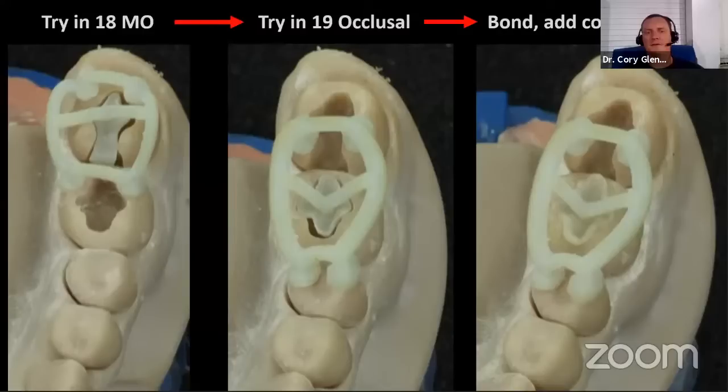Well, with this, all of those key areas of anatomy are being located ahead of time. And these little feet index it into the tooth so that it's in the perfect position as their pre-op anatomy or their wax-up, if their tooth was bombed out and you had done a wax-up in Blue Sky Plan, same difference. And so at this point, you just place some composite into the prep and you squish this down, index it on those adjacent teeth until it's fully seated. And as you see, it squishes out some excess there on the far right. I just take an endo explorer or a brush and just tease away that excess and then light cure it all.